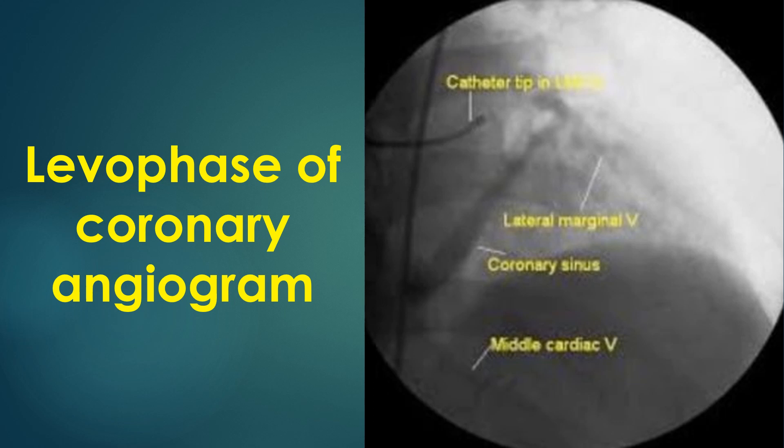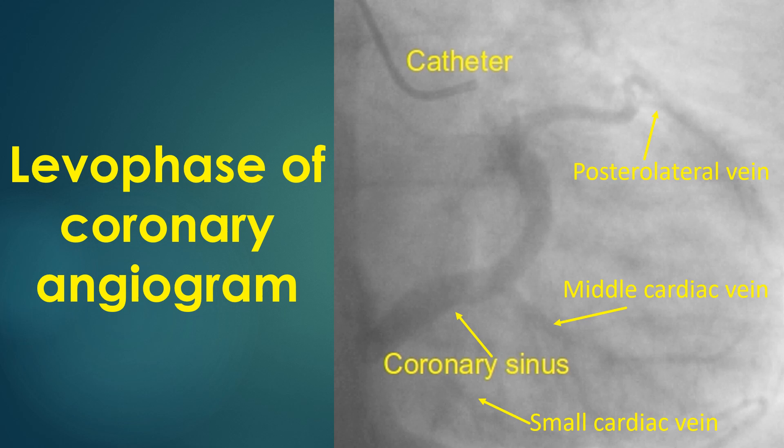The catheter tip of the left Judkins catheter introduced via the transfemoral route is engaging the ostium of the left main coronary artery. In another case, the coronary angiogram levophase shows the catheter engaged in the left main coronary artery. The artery is not visible as it is the levophase.